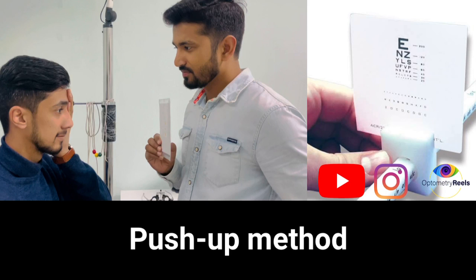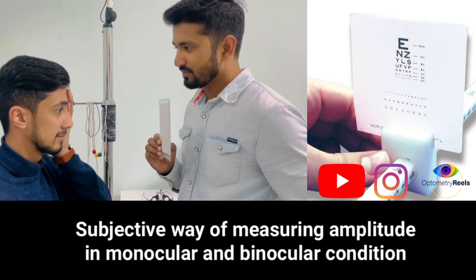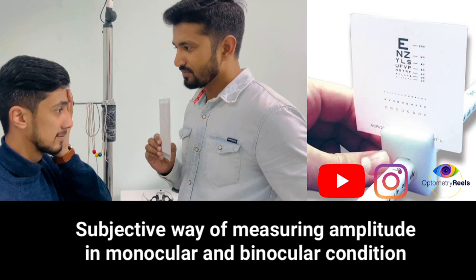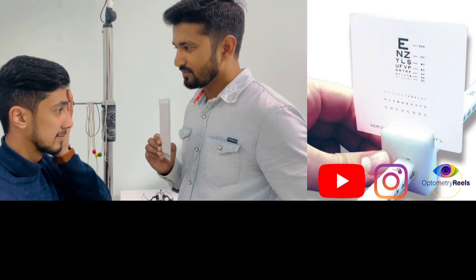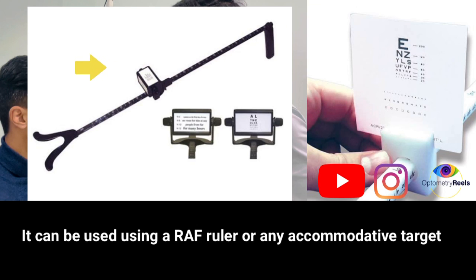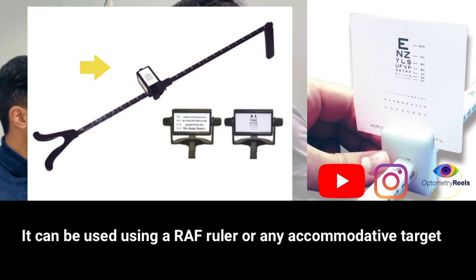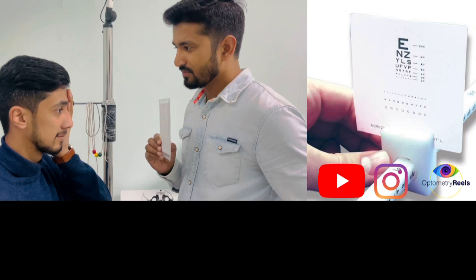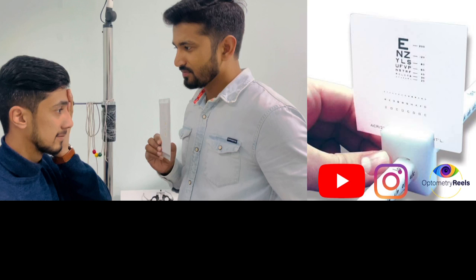Near point of accommodation, or NPA, is a subjective method of measuring amplitude of accommodation in monocular as well as binocular condition. One of the instruments to measure NPA is the Royal Air Force Ruler, but even if you don't have this, it can still be measured — you just need any accommodative target like a regular near vision acuity chart.